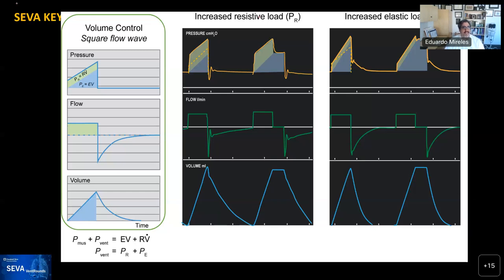We always start with a key knowledge point. Today I want to focus on how a volume control square wave flow waveform looks and what its components are. On top is pressure, in the middle is flow, and on the bottom is volume. These three waveforms are idealized, and then you have what would happen with an increased resistive load or an increased elastic load. These waveforms from an actual ventilator show clear similarities.